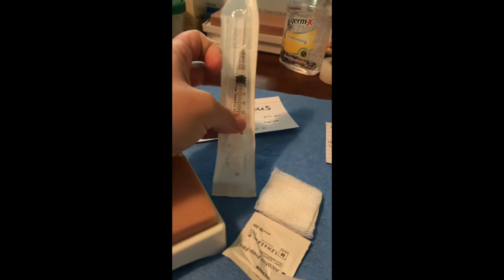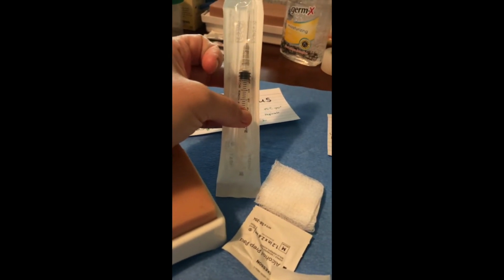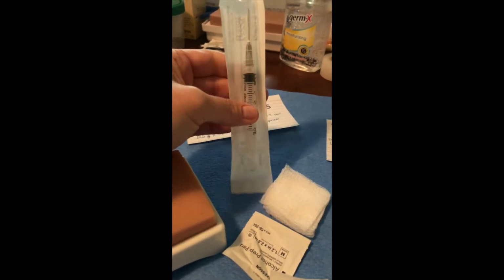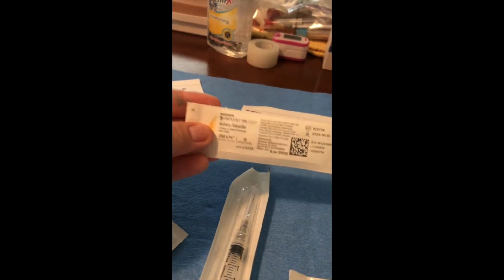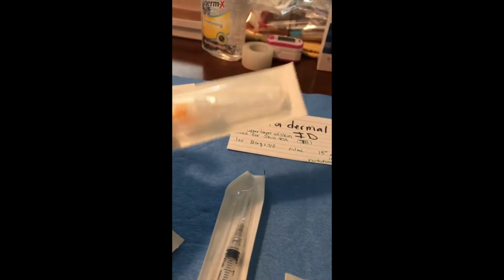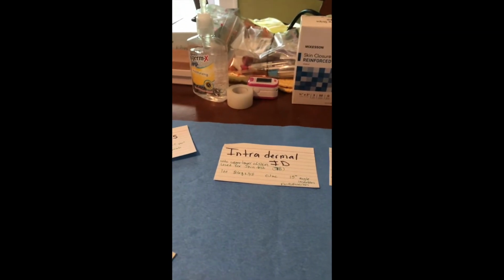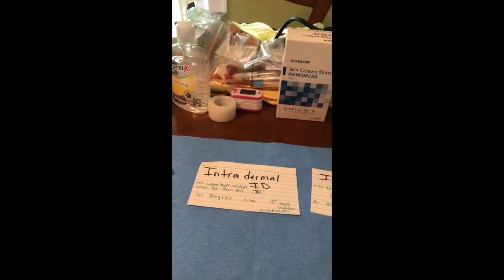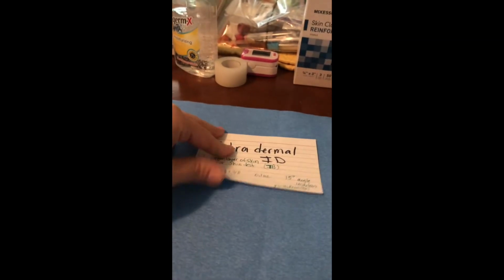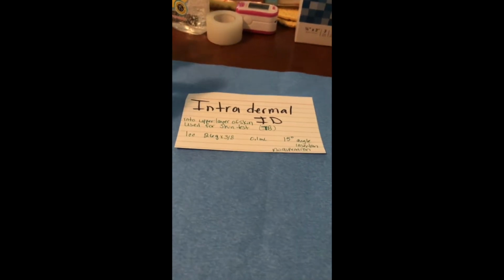And this one already has a needle on it because I always use a draw-up needle separate from the needle that I'm going to do the injection with. So I have that, plus my needle that I'm going to change to. Now this is a 25 by 5/8 safety needle. That's what we're going to use to draw up for our subcutaneous.